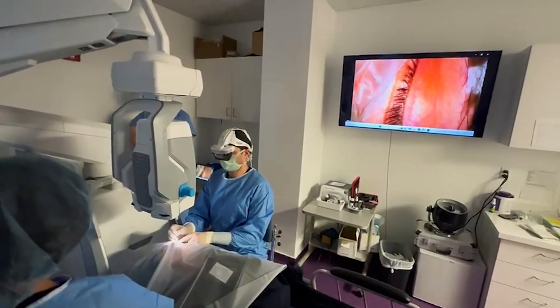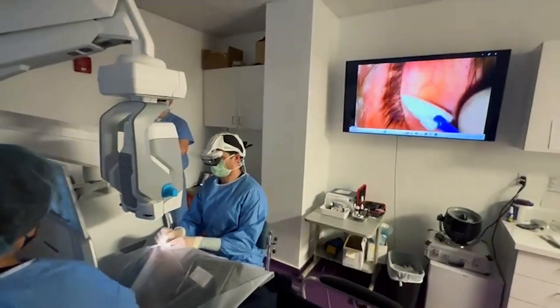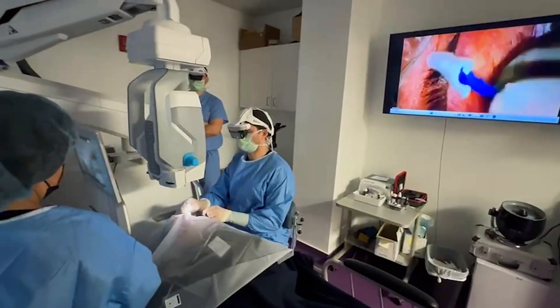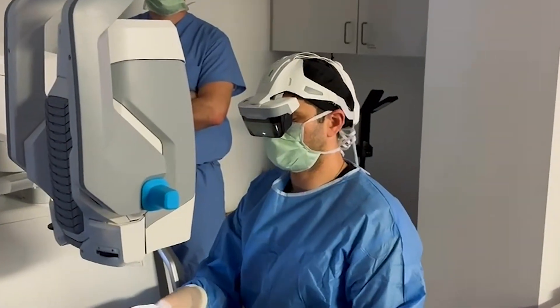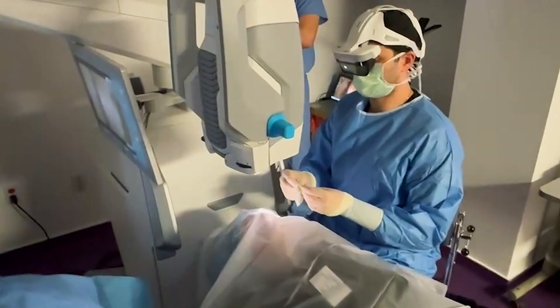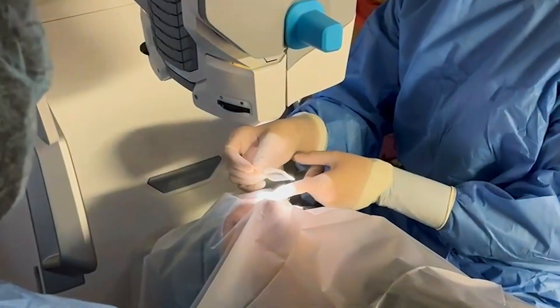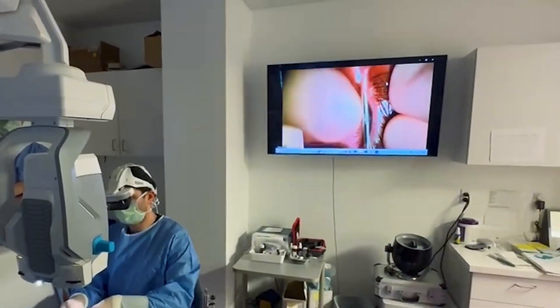Once the lens is ready and loaded, we are now ready to position near the eye. I'm cleaning with a little sponge, making sure it's nice and dry so I can put some tegaderm over the lashes and get them out of my way. Here's a closeup of the headset itself — I am looking through a simulated image as if looking at a three-dimensional television about three to four feet in front of me, even though of course there's no screen there.